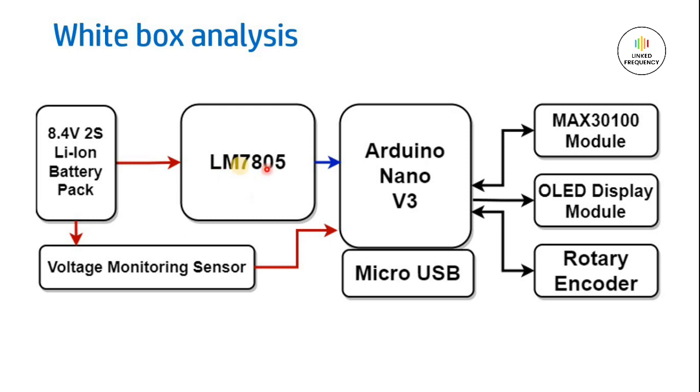This is a DC power supply which converts the 8.4 volt into 5 volt, and then we have a voltage monitoring sensor here, which is again a voltage divider network most of the time, which will monitor how much voltage is left in this lithium-ion battery pack. At the main controlling unit, we will have an Arduino Nano development board, commonly called Arduino Nano V3 in the market. And we will have a micro USB cable along with that so that we can program the Arduino Nano development board as per our requirement.